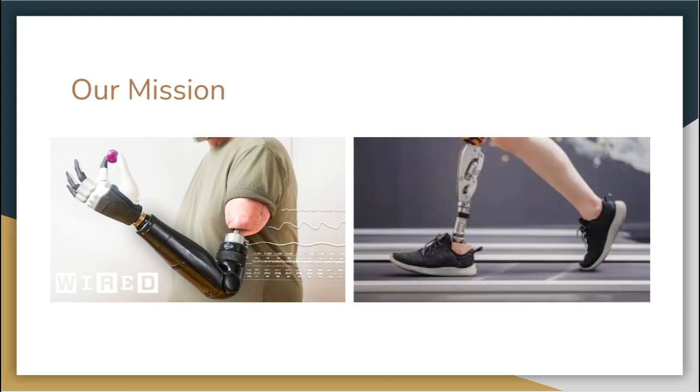Mechanical prosthetics are marvels of design. They use advanced materials like carbon fiber and titanium for strength and flexibility. Mechanical engineers play an important role in the blueprint for the prosthetics. The human body is composed of different body parts that have different functions, meaning there are a variety of prosthetics which must be constructed. Some examples are lower limb prosthetics, which replace missing legs, upper limb prosthetics, which replace missing arms, bionic limbs, which offer a more fluid range of motion, and osseointegration, which enhances stability and functionality.